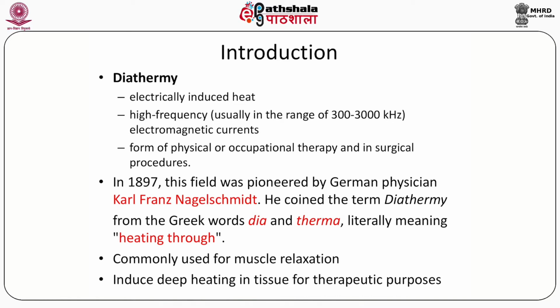The most common use of diathermy in today's scenario is muscle relaxation. Also, diathermy induces deep heating in tissues for therapeutic purposes.